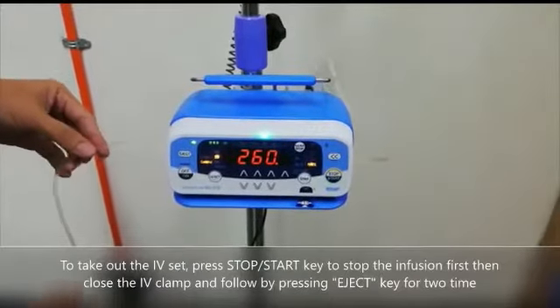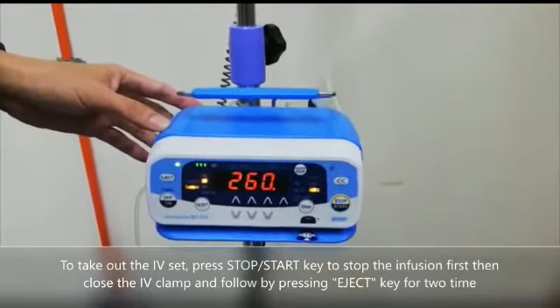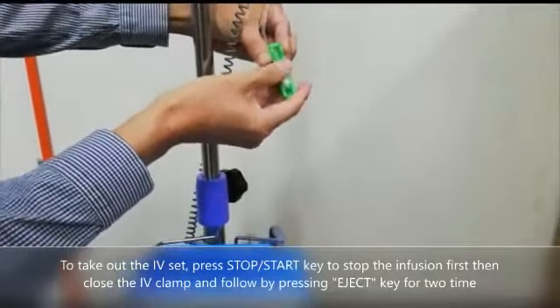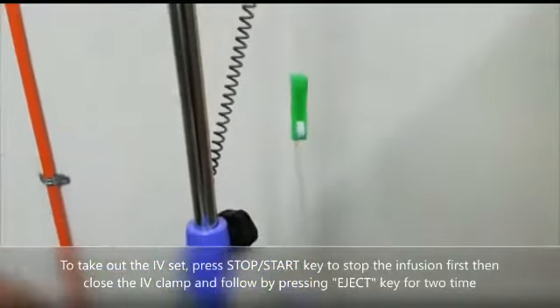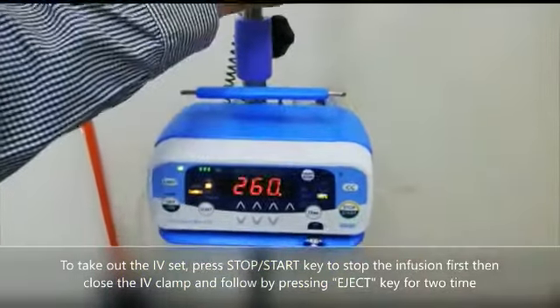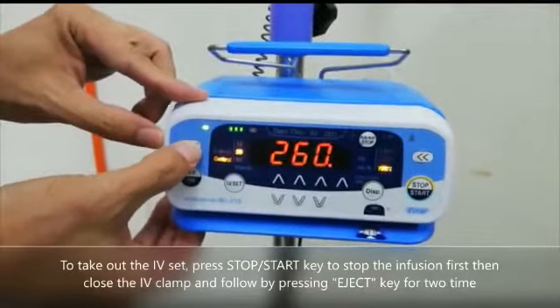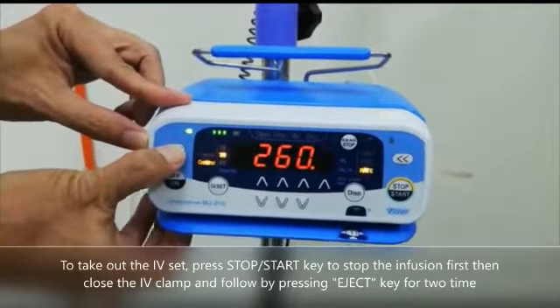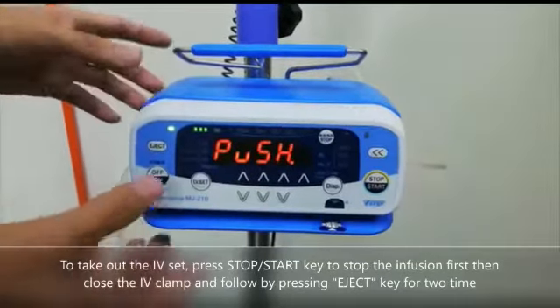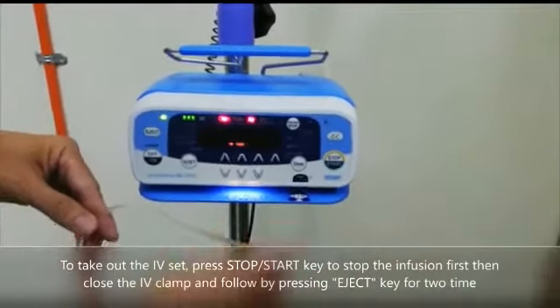To take out the IV set from this pump, you stop the operation first. Next, very important, you should clamp the IV set. The IV set has to be clamped to make sure there's no free flow while taking it out. So you have to clamp this one. Next, you press the eject key here. Press. You see the alarm will lock. Eject pushed. So you need to press eject one more time. Okay, you can see the light is on, so you can take it out easily.